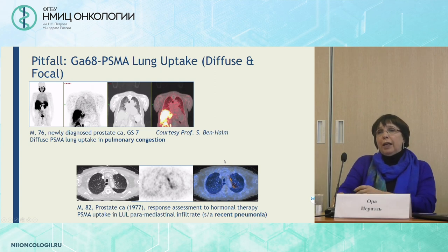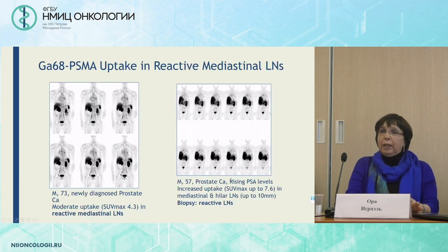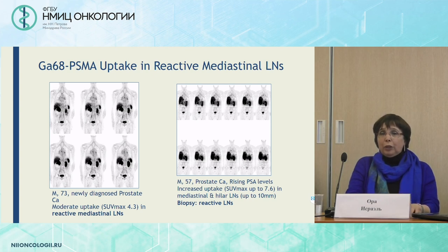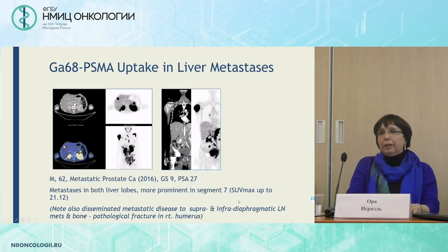There can also be diffuse lung uptake, as seen in these examples — in one patient it was pulmonary congestion, and in another patient it was recent pneumonia. Regarding uptake in the mediastinum: when the uptake is of moderate intensity, you can report it as reactive nodes. But sometimes when the uptake is higher, we should know our limits and refer to tissue biopsy before making the diagnosis of reactive lymph nodes.